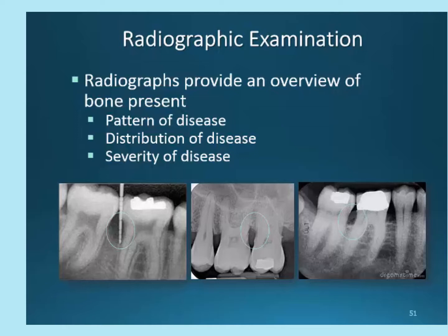Another important concept is when you take your probing measurements, you will have lingual and buccal readings that may differ. This may be seen in radiographs. Take note on image 1 with the probe. You can faintly see a level of interproximal bone intersecting the probe. This is caused because the bone loss being measured is only on one side. We cannot determine from a radiograph which side bone loss exists, but we do know that the probing depths will identify this. It is either going to be a facial or lingual bone area of destruction.